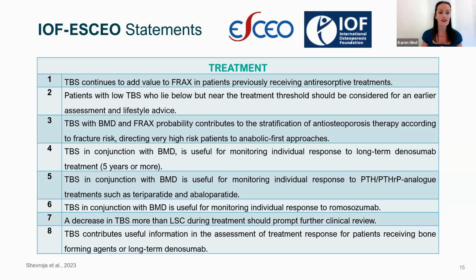It was identified that a decrease in TBS more than LSC should prompt further clinical review, and TBS also contributes useful information for assessment of treatment response for patients receiving bone-forming agents or long-term denosumab.